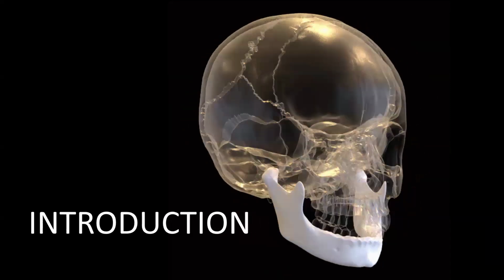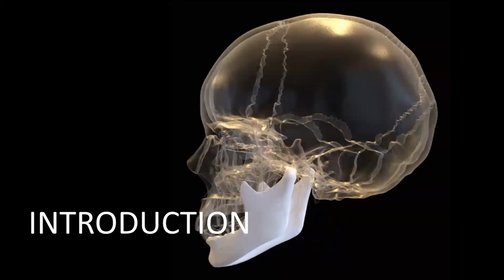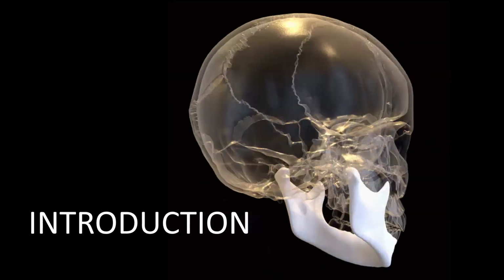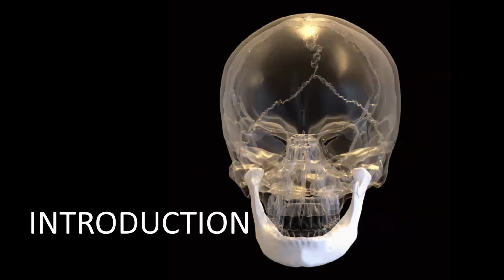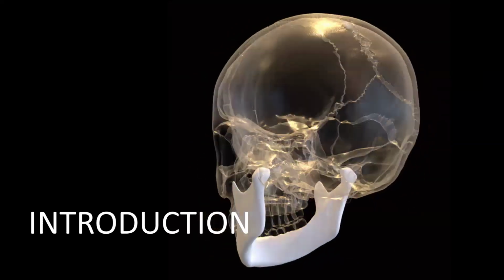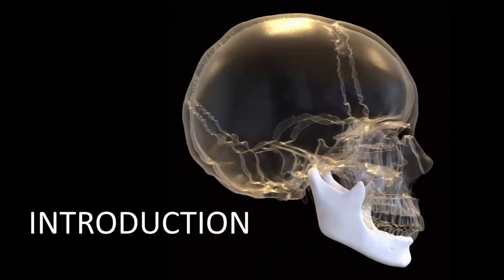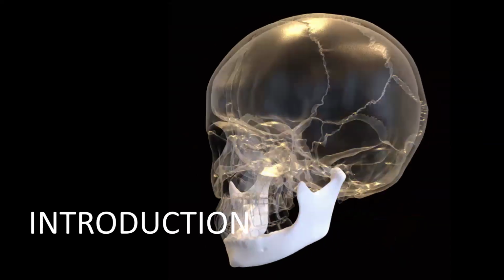It can be the horizontal plane, the vertical plane, or the plane along the rotation of axis. A clinician's expertise is required to determine the accurate measurements and relation of the maxilla to the mandible in order to fabricate a prosthesis which is able to be functionally and aesthetically viable to the patient.